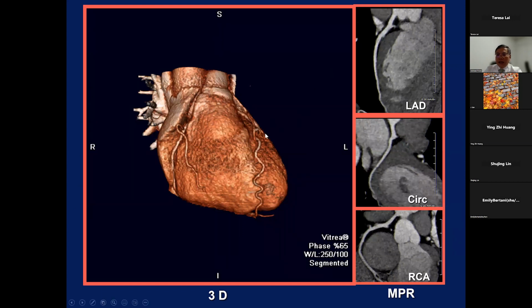The patient had a CTA, and this is the picture of the CTA. It turned out that this patient had a completely normal coronary. So that little apical defect that the nuclear cardiologist saw on the scan was an artifact. Even though the patient was not able to achieve adequate heart rate, the coronary is completely pristine. There's not even one plaque sitting anywhere in this patient's coronary artery.